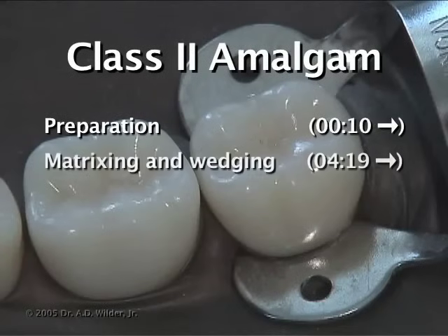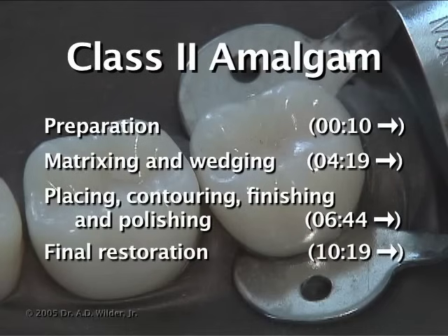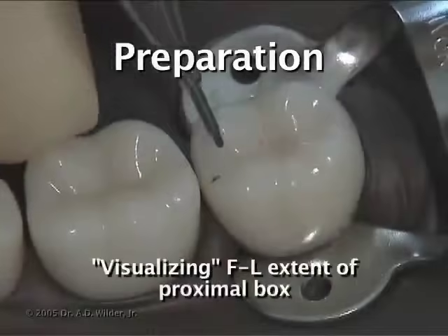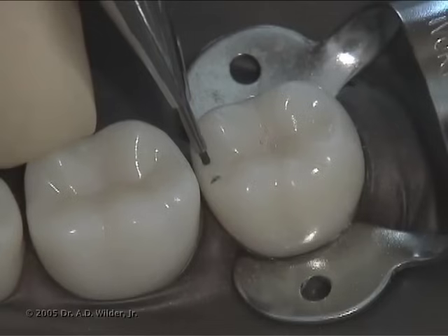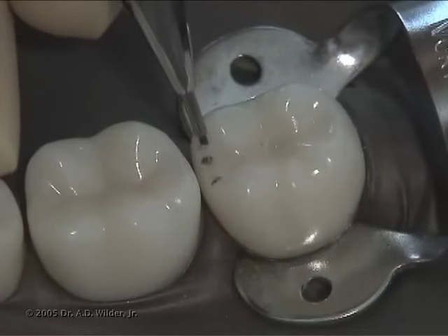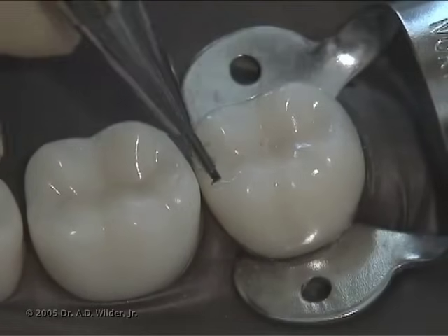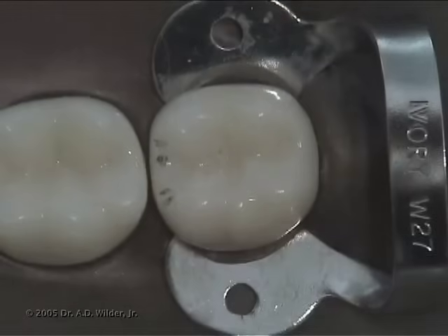Thank you to Dr. Wilder for preparing this video. For the sake of this instructional video, we'll first use a pencil to visualize the facial lingual extent of the proximal box. These walls may need to be extended further depending on the extent of decay. Ideally, there should be about 0.5 millimeters of clearance between where these walls exit and the adjacent tooth, but we'll get into that more later.